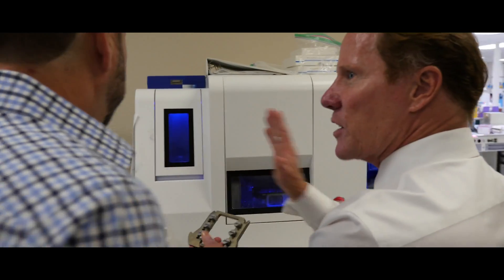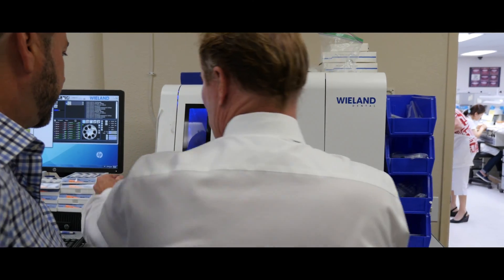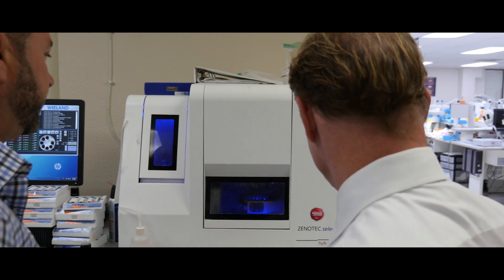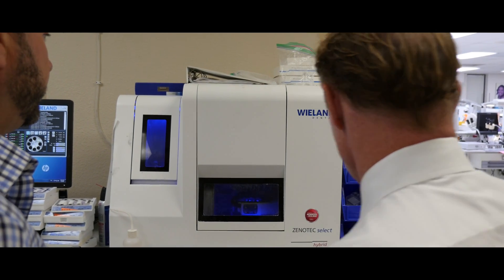These cartridges hold six blocks each, and there are eight cartridges, so you can mill up to 48 units at a time. That's amazing.